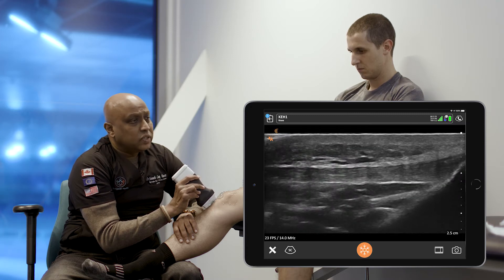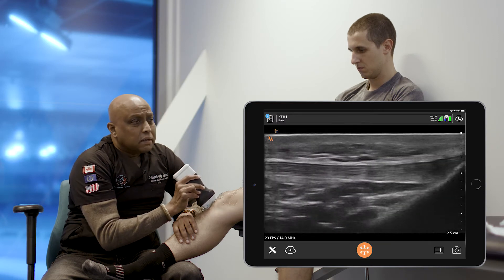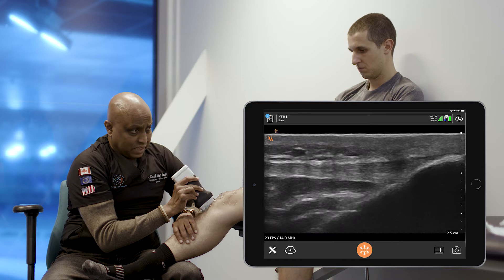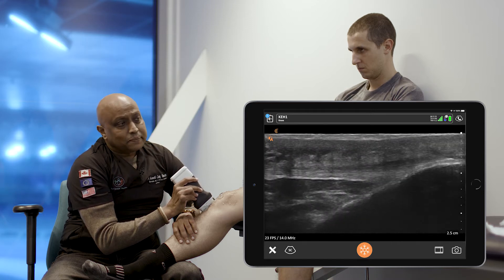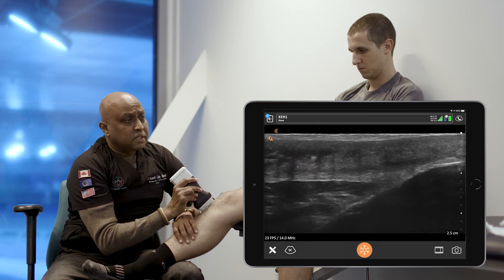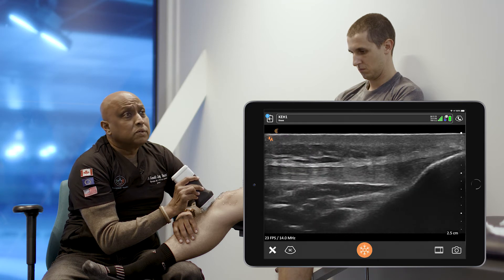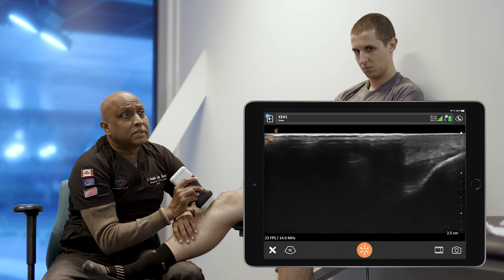Nothing here is actually related to today's activity. This is the kind of interaction where I can engage with my athlete while scanning, where he can also appreciate what has occurred and what is occurring. It gives us a different level of clinical care. If his trainer or teammates were here, we could explain Daniel's condition right now — what to expect, what not to expect, what not to force him to do, and how he should train. This is invaluable in clinical practice.